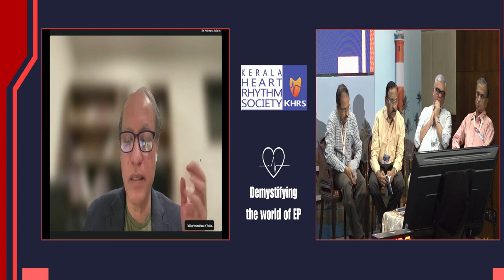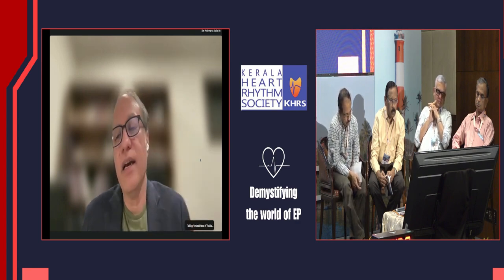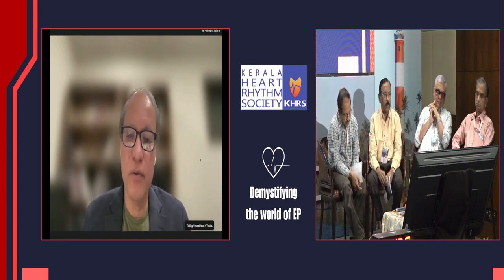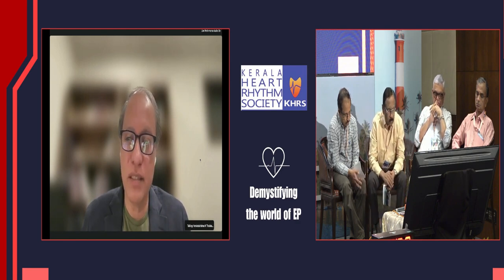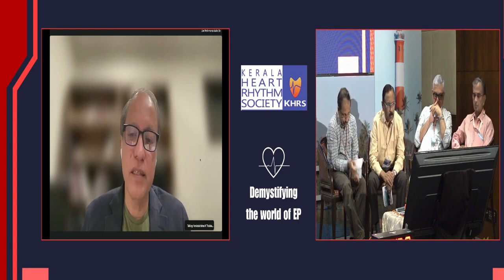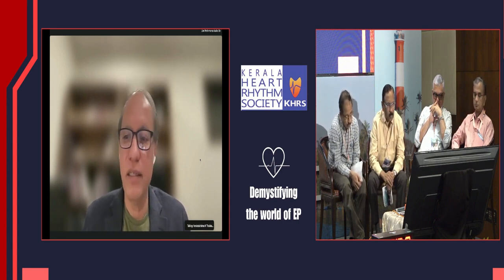They are going by fluoroscopy and intracardiac echo guidance, although ICE can be quite expensive again, and some places are even doing it just by fluoroscopy, similar to what you do with cryo. But of course, you don't need to use contrast and other things. So in this way, I think it is going to change quite a bit. Especially, you don't need to monitor the esophagus, phrenic nerve, and all those things.